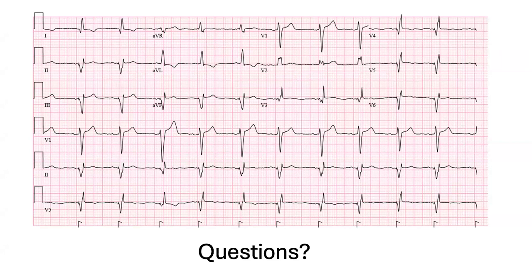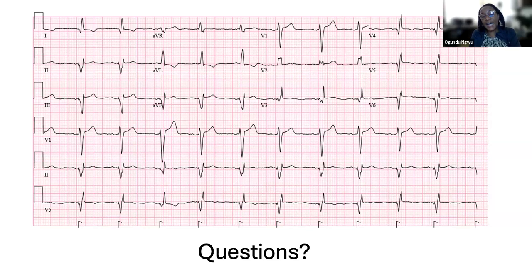Then your third question is about conduction system pacing, left bundle area pacing. Which patient do you defer for that, apart from putting them on BiV pacing? Well, I've had a few patients where I start off with the intention to do a CS lead, and I go in, do a CS venogram, and there are no optimal options. So for those patients, I would already have a plan that left bundle pacing will be my bailout option. So I do have patients that I start off with a view to put an LV lead in.